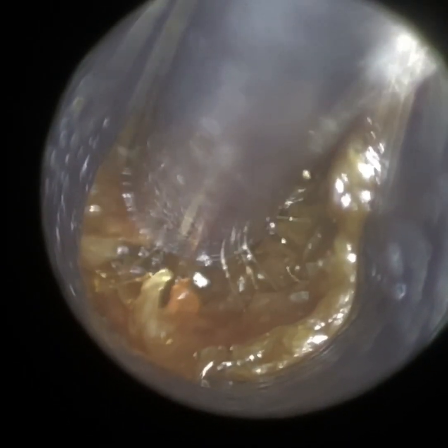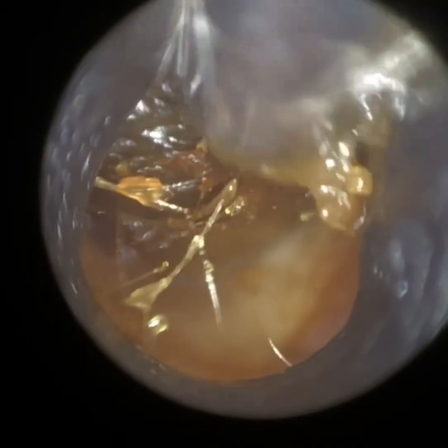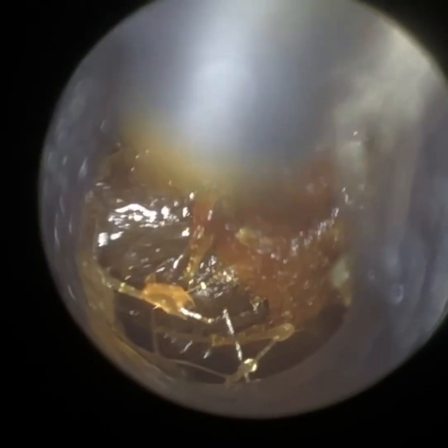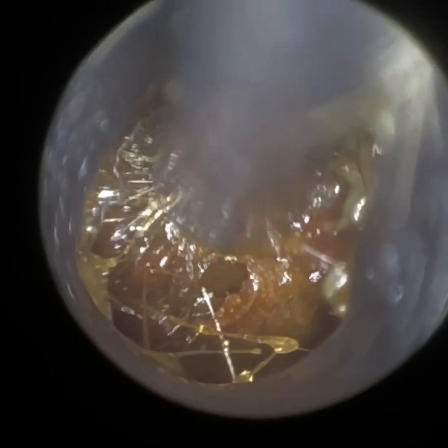We have a patient here who attended with a blocked left ear. They've been trying to use various earwax softening drops and sprays over the counter in the hope of removing this wax by themselves. They also did admit to getting water in the ear, which then exacerbated their symptoms. Their primary complaint was the pressure sensation in the ear, though their hearing was affected as well. The patient also advised that they wear sleep plugs at night.